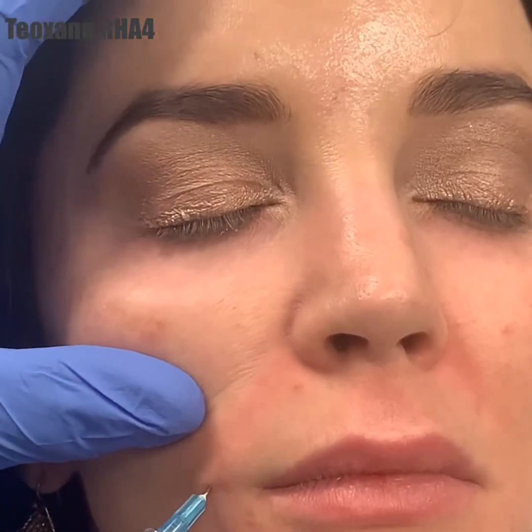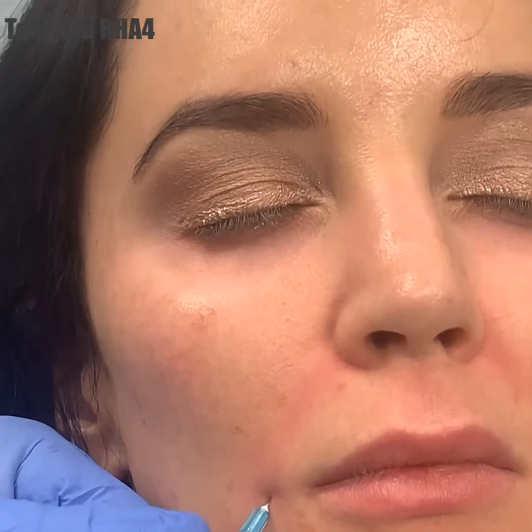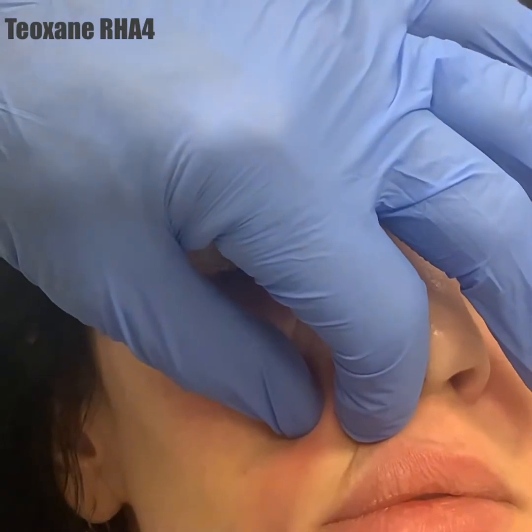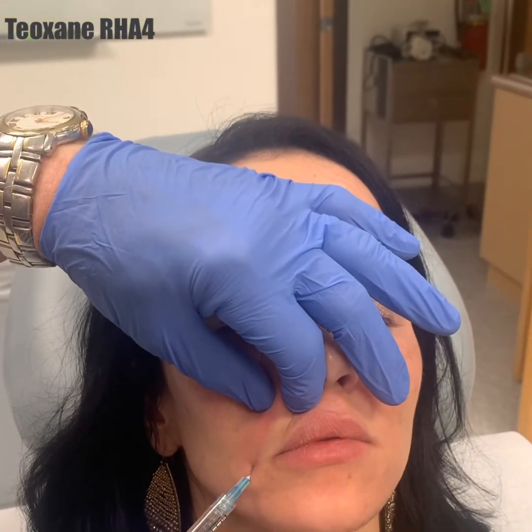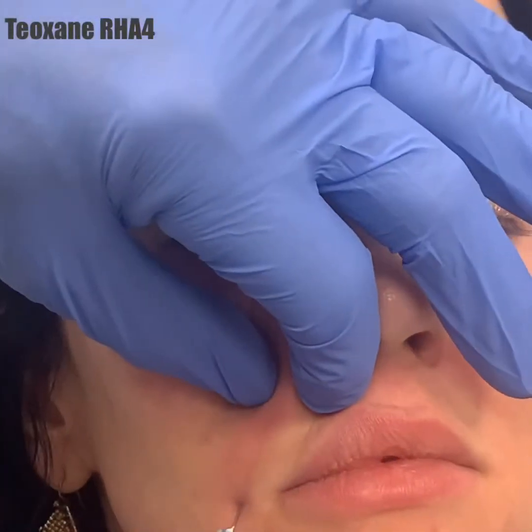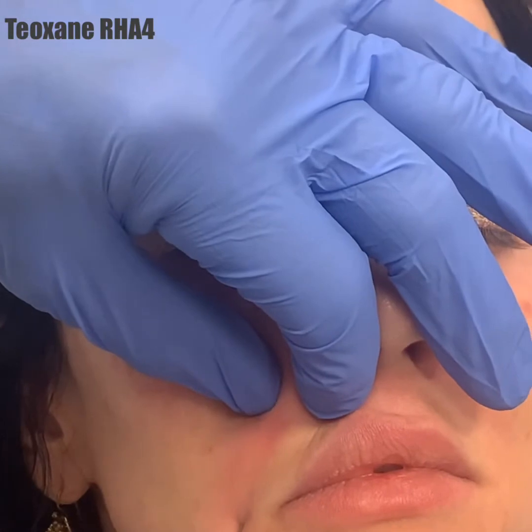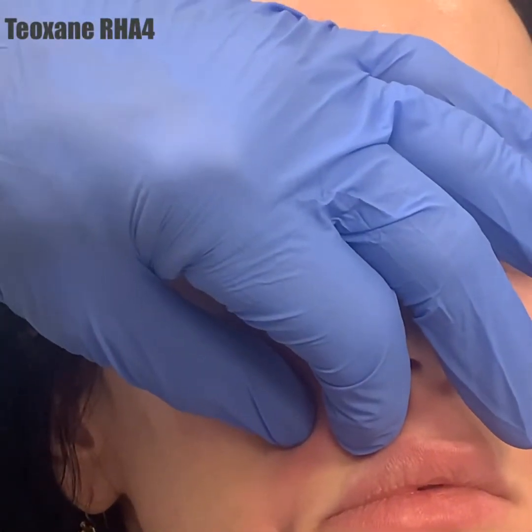My technique is to use the fewest number of pinpricks possible in order to perform the procedure. The little device that you saw is a distractor that makes it difficult to even feel the pinprick. Here in this video, I'm using my hand to compress and contain the filler in the laugh line rather than having it go laterally either toward the lip or out toward the cheek.